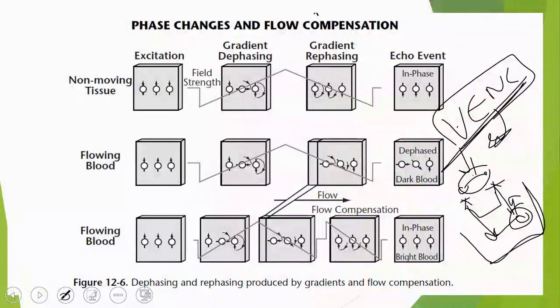This is what happens in cardiac imaging. With the movement of the heart, or with cardiac movement, there is a change in the movement of the voxel. If you take flow in it, movement occurs. Therefore, there is a need for high detectability regarding the flow that occurs.